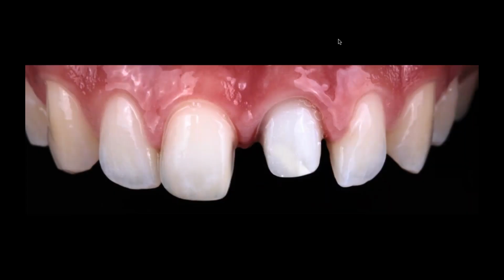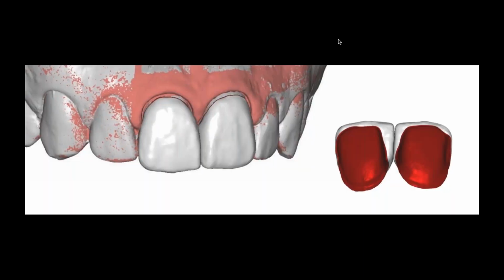So in these cases, we understand that central incisors are very symmetric. They are next to each other, and they need to be very similar. So we prep very conservatively a veneer on number 8 to be able to have symmetry between those 2 centrals without having a very wide crown on number 9 and creating a nice midline. So Michael starts designing from outside inside, like reverse engineering.